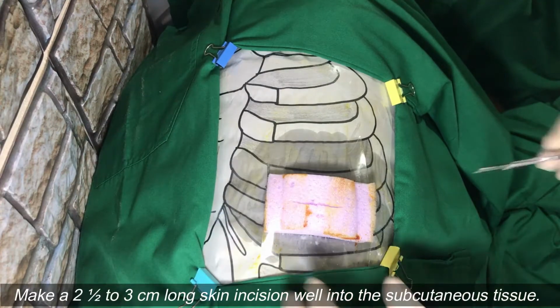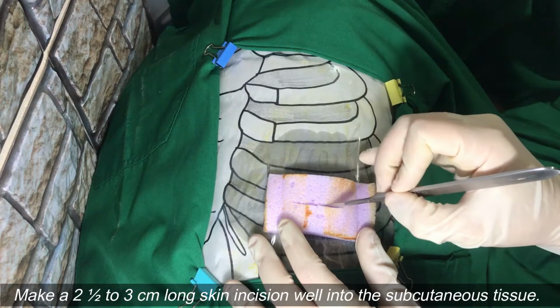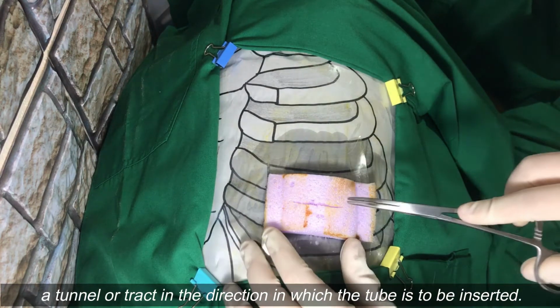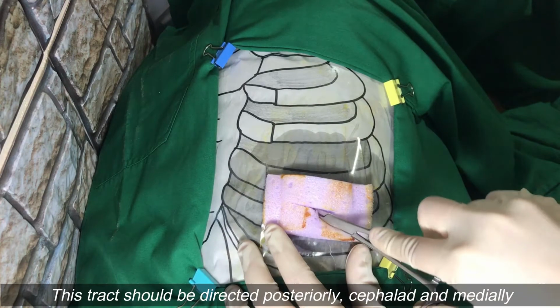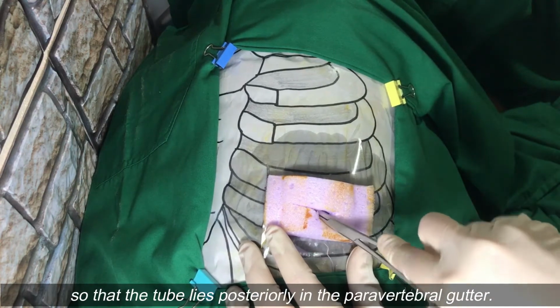Make a 2.5 to 3 cm long skin incision well into the subcutaneous tissue. Insert a curved Kelly clamp and separate the tissues so as to create a tunnel or tract in the direction in which the tube is to be inserted. This tract should be directed posteriorly, cephalad, and medially so that the tube lies posteriorly in the paravertebral gutter.